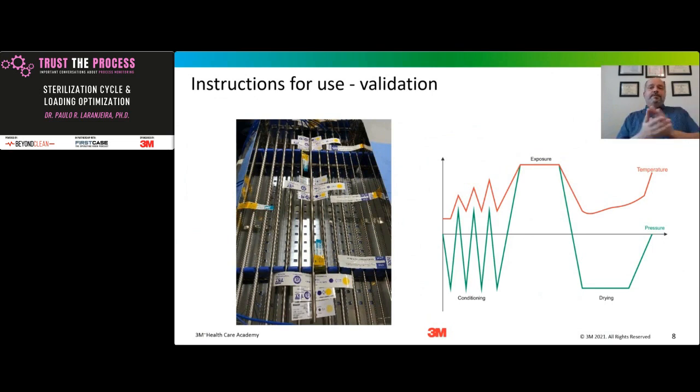But the point is, when the manufacturer of the medical device validates the instruction for use, they are validating the sterilization cycle using only their load. And even if they try to mimic, it is impossible to mimic the load that you have in hospitals. It is impossible to simulate every single institution load that we have in the US and globally.